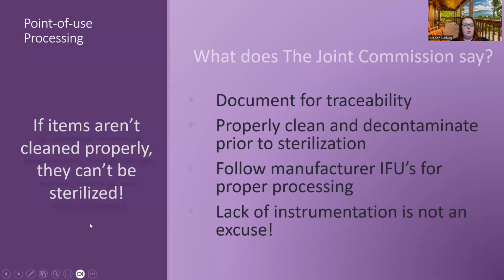Okay. Here's also an important thing. If items aren't cleaned properly, they cannot be sterilized. So if you're not brushing that lumen or whatever it is, you might leave something behind, which could render that whole sterilization process completely useless. So make sure they get cleaned properly.